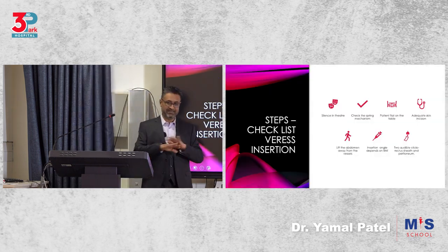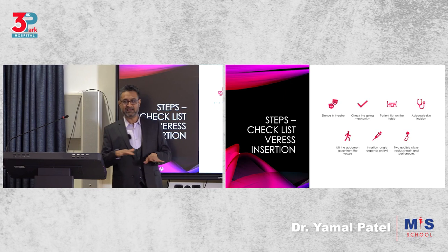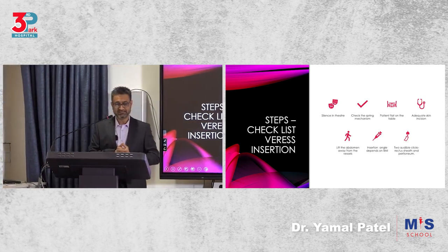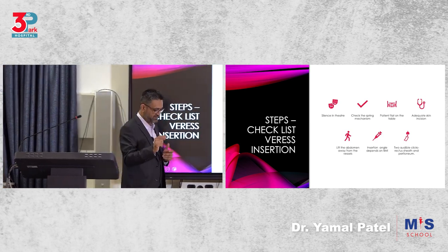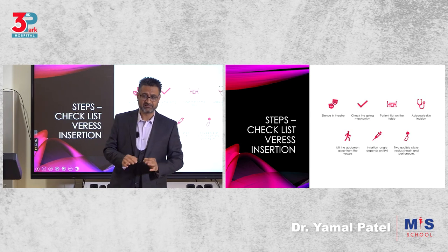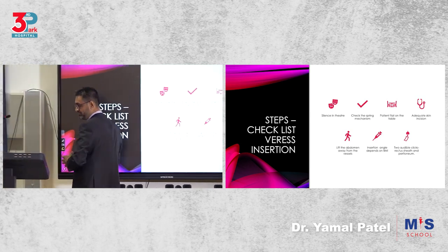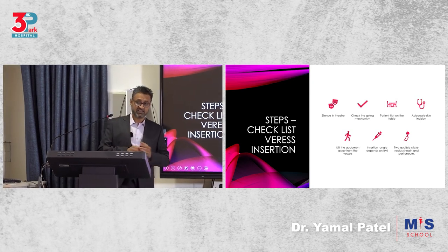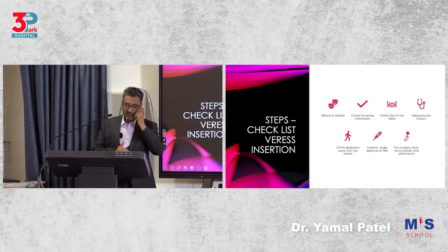So these are some of the basic steps, just to lay down the basics. In Veress, number one, try and maintain silence, because people using Veress are going to feel for clicks, and they're going to try and listen for clicks. So don't have a very noisy theater. Check the spring mechanism. That's for the nurses. Check the spring before you hand it over.